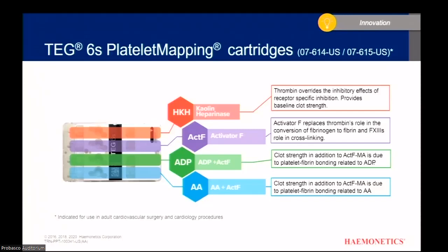And so that is just the way it will be in Epic, the lab sheet that goes in the trauma order set. So that is a change. It will still be just a green top and a blue top, but it is two separate cartridges to get the same information that you have now.